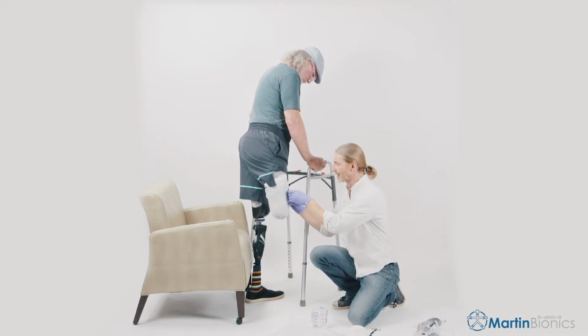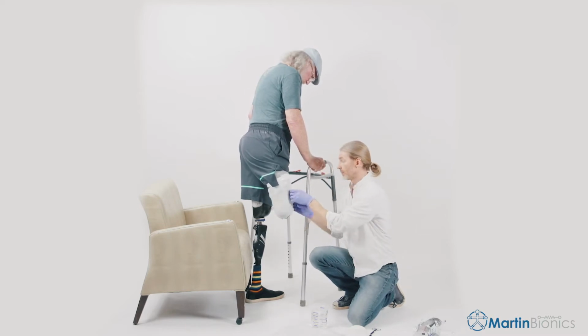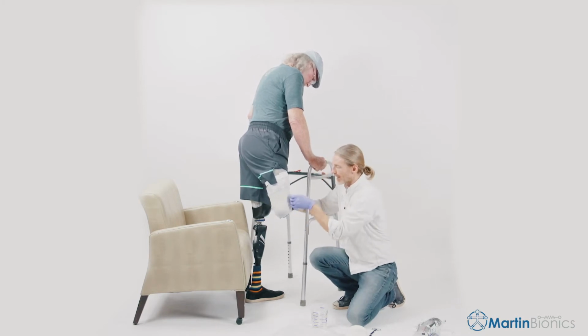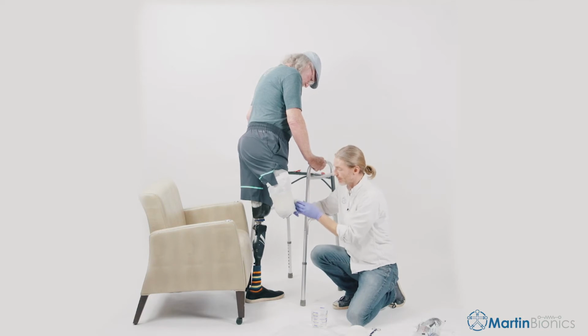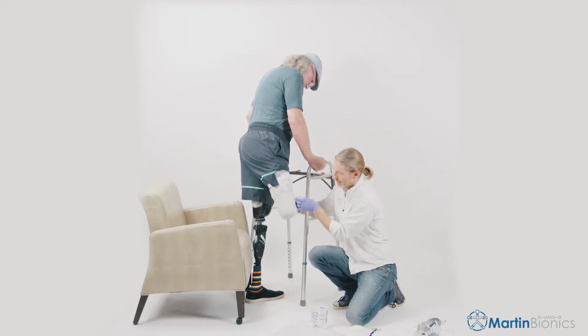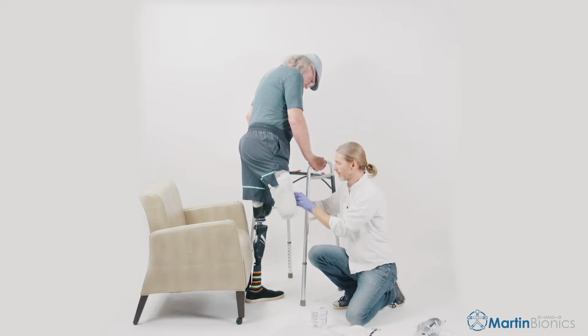Now we don't need to cast the proximal half or the brim of the socket because, well, we're not going to have a proximal half or a brim of the socket. With the CX hybrid design, the proximal half of the socket is effectively just the socketless socket components. Just want this to be as even and symmetrical as possible. Nice smooth cast.